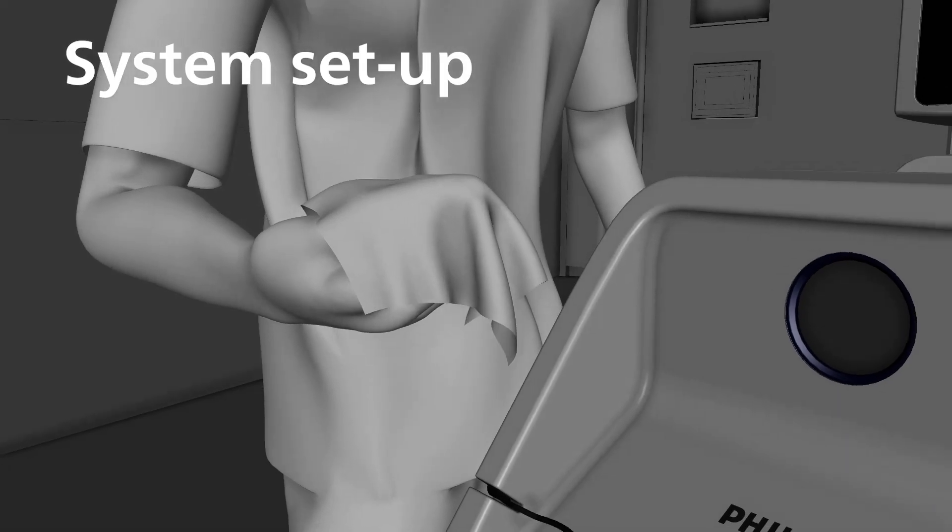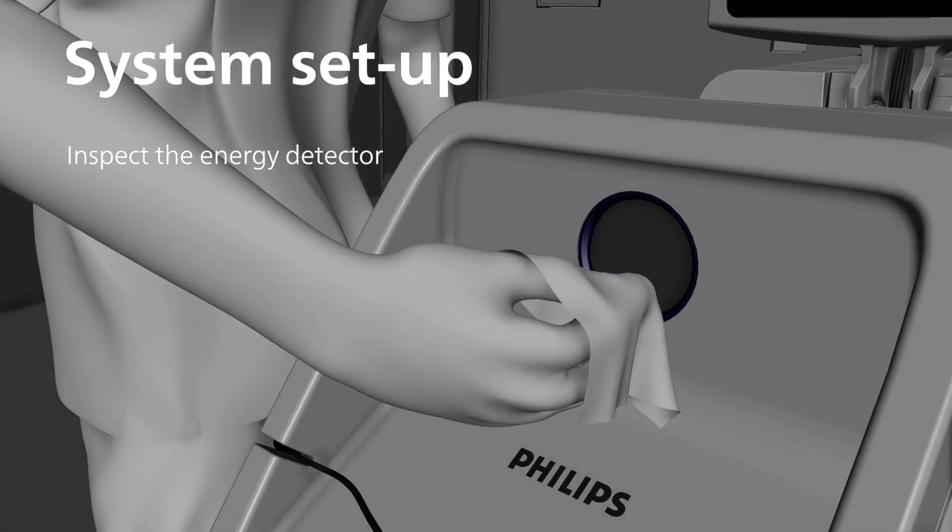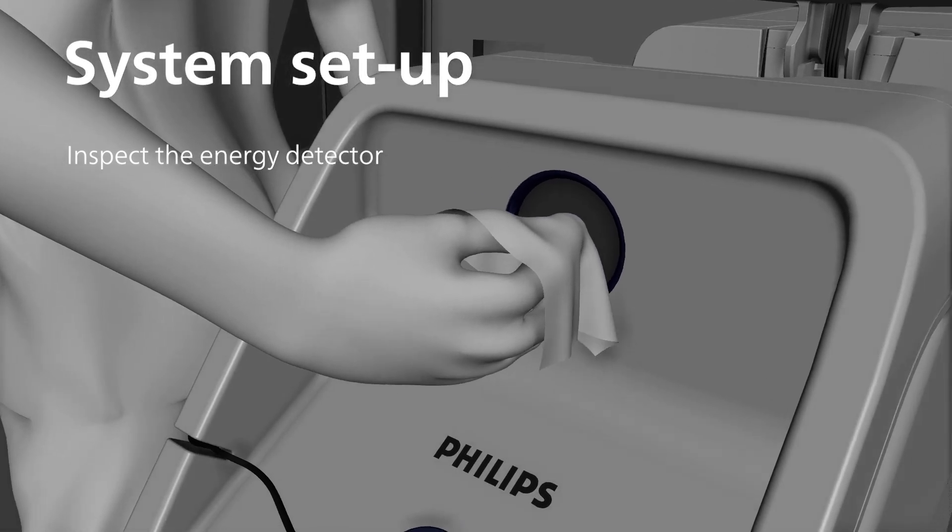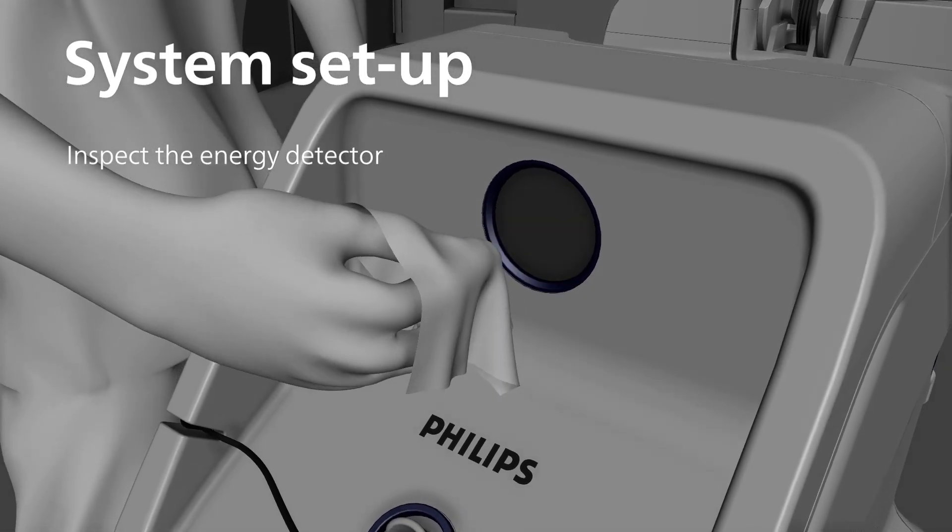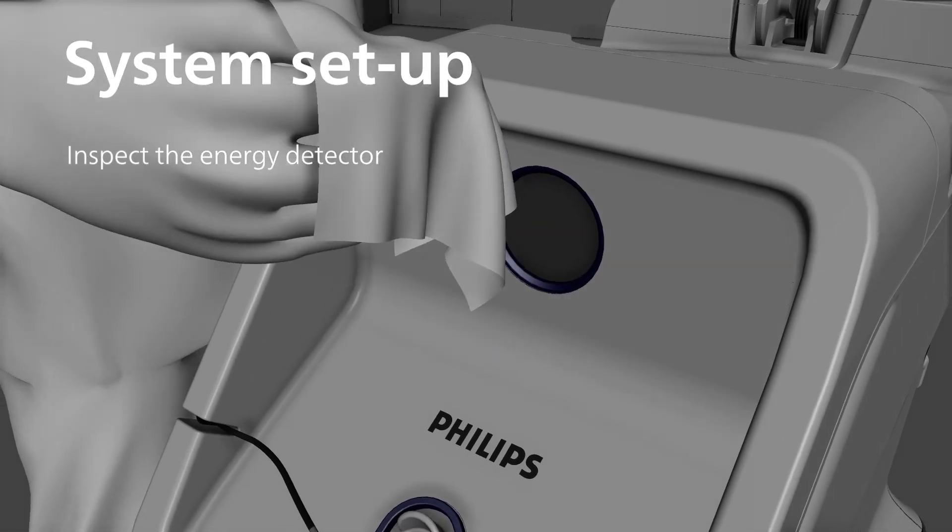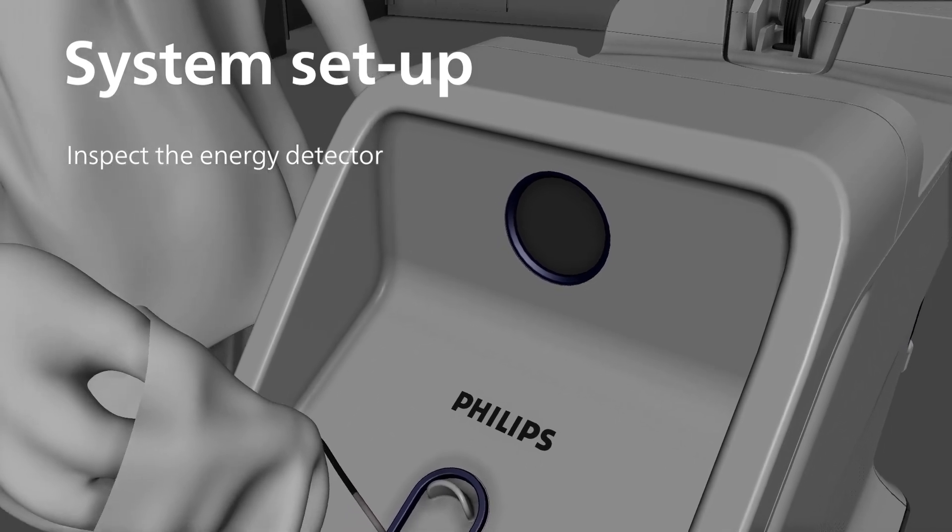Inspect the energy detector. If it is dirty, clean the surface of the energy detector with an alcohol prep before and after each use.